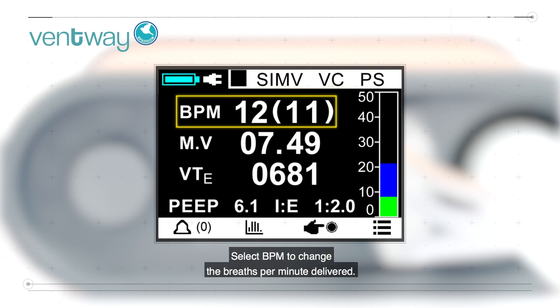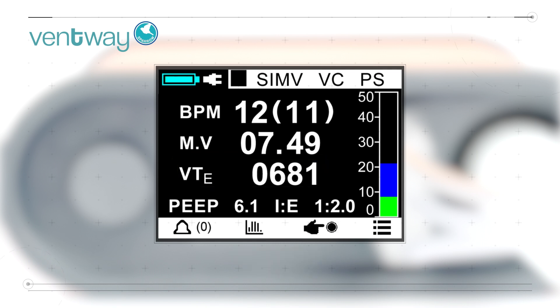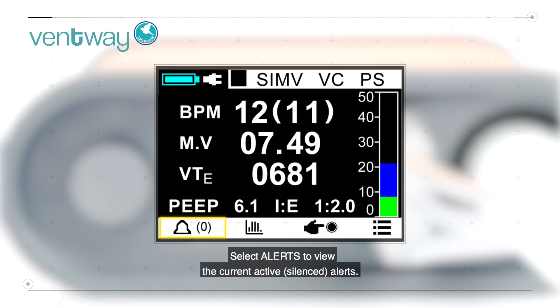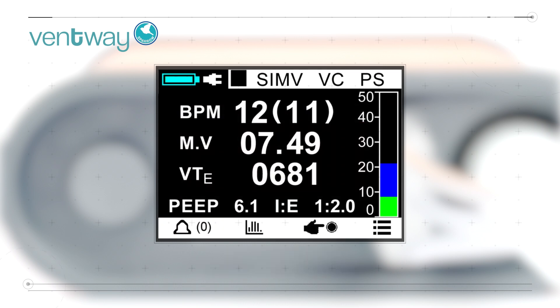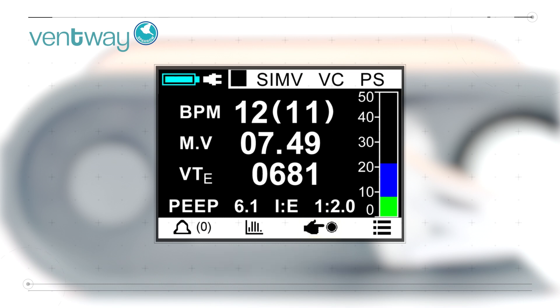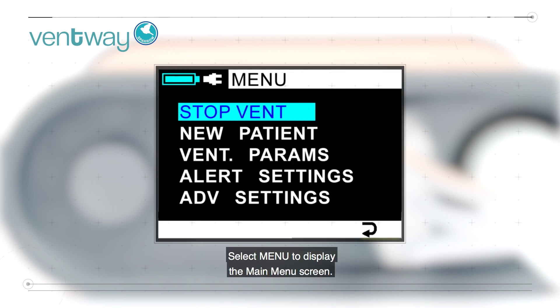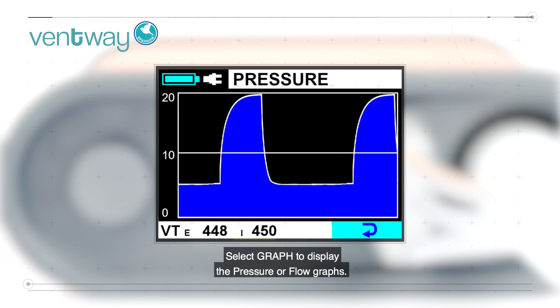Select BPM to change the breaths per minute delivered. Select VTE to change the desired VTE. Select alerts to view the current active and silenced alerts. Select manual breath to give one breath to the patient using the current parameters. Select menu to display the main menu screen. Select graph to display the pressure or flow graphs.